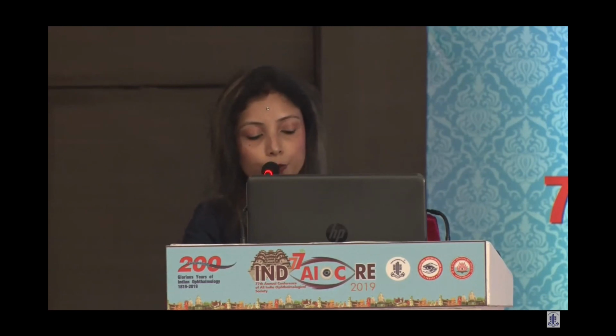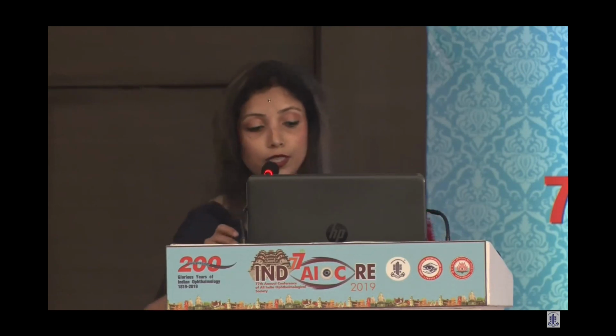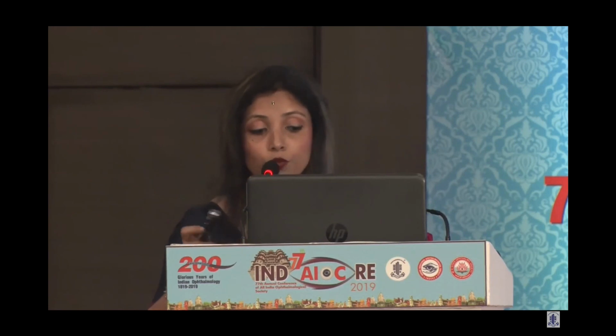After the instruments have been washed, cleaned and scrubbed, we want to dry them. The drying in our OT is done by a hair dryer because any amount of moisture left behind often causes rusting, and we do not want the instrument life to be lessened. So we dry all our instruments with a hair dryer.